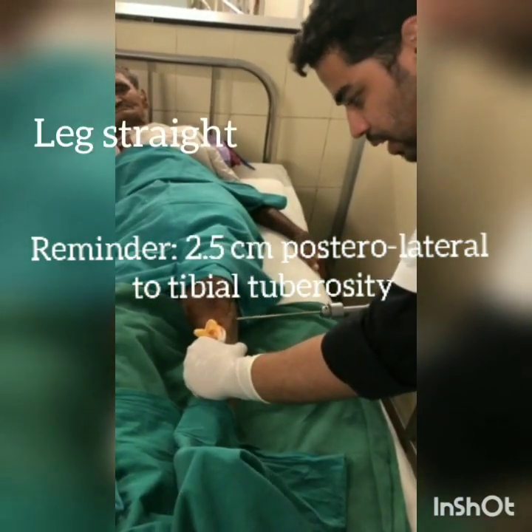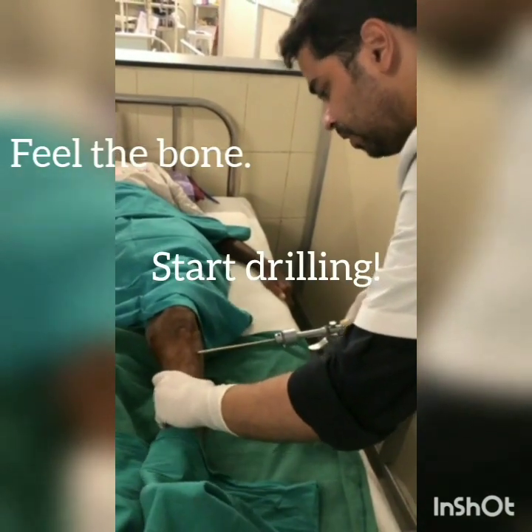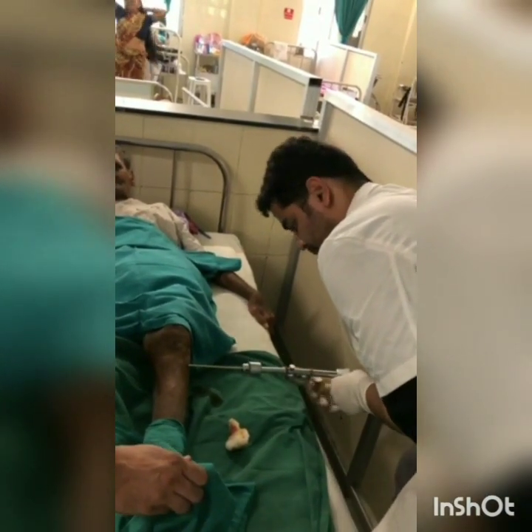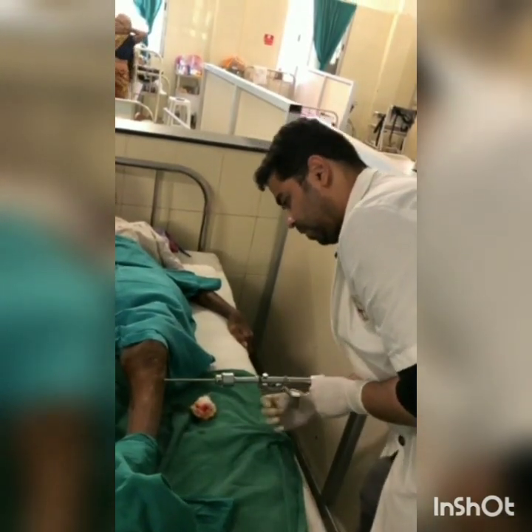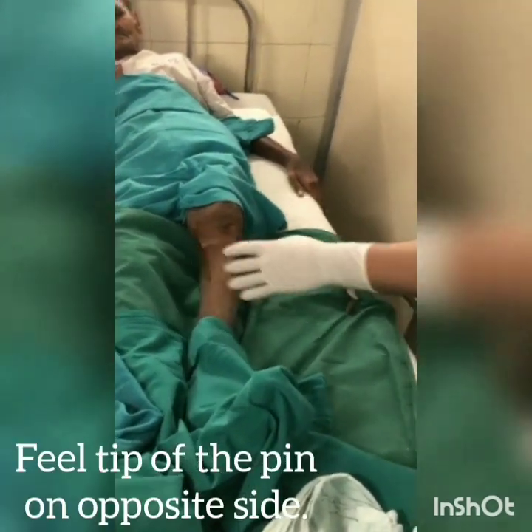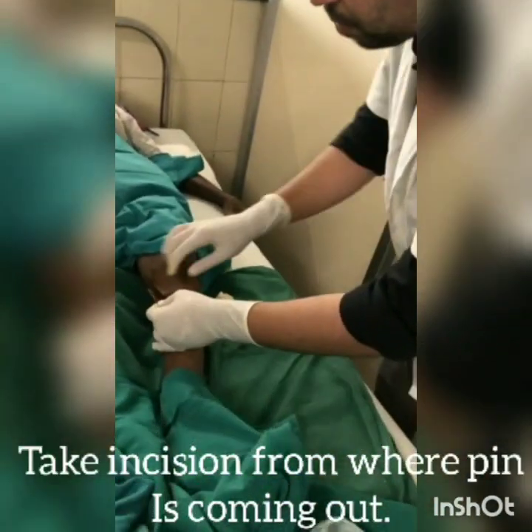The leg should be kept straight and the pin should be parallel to the bed. We have to feel the bone and start drilling. I have felt the piercing of the first cortex. Now after piercing the second cortex, we will feel the tip of the pin over the skin. Then we have to take an incision over that prominent point on the skin with the help of a blade.